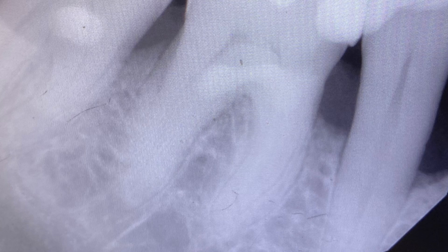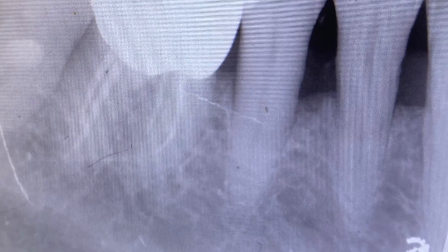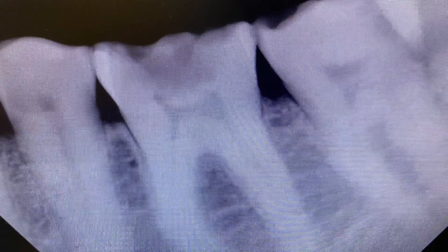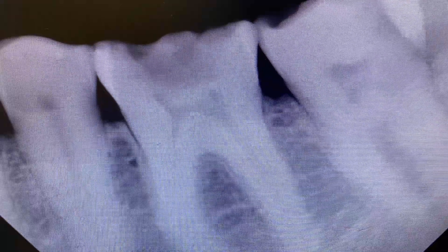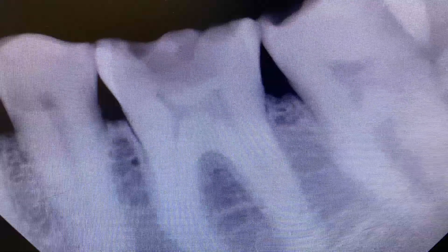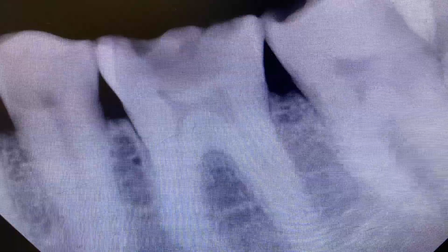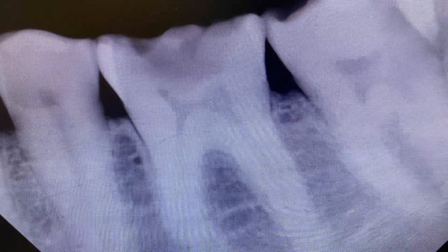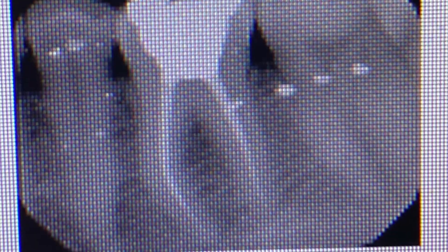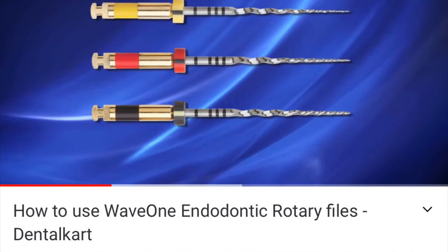Once you identify the canal, the file will do the job for you — you don't have to worry about breaking the file. It's amazing. Here's a third case — you can see the pulp chamber, but as you go down it gets really narrow. Cases like this, you just get excited because you know Wave One will help you out and make your life a lot easier.